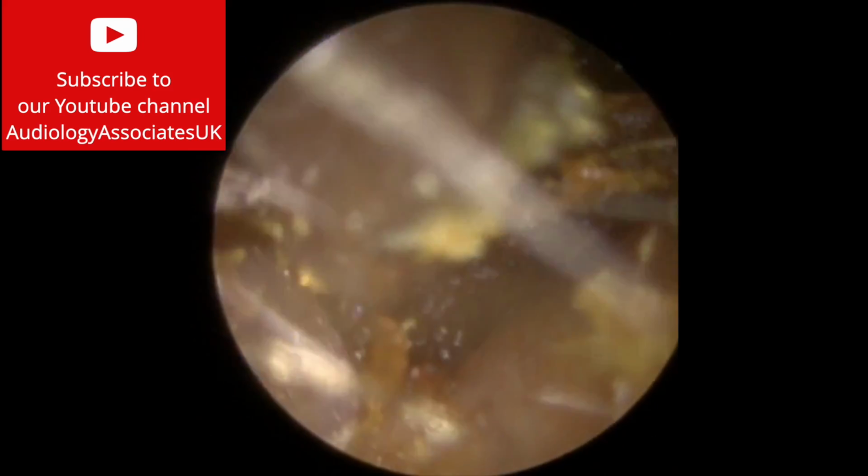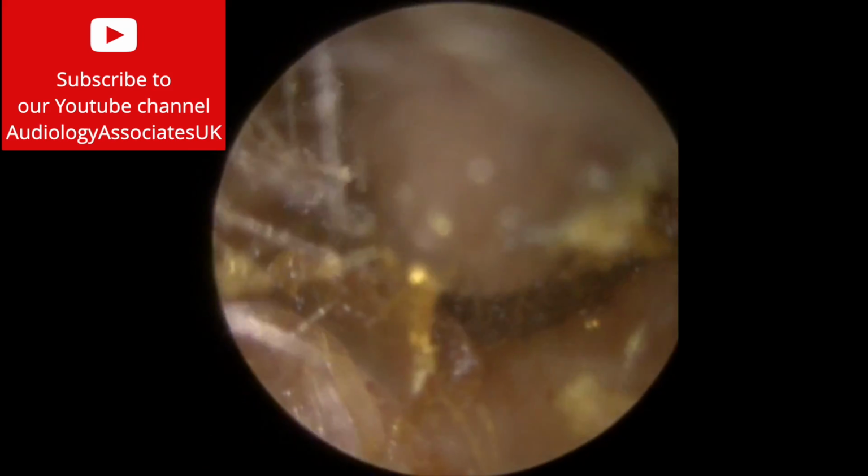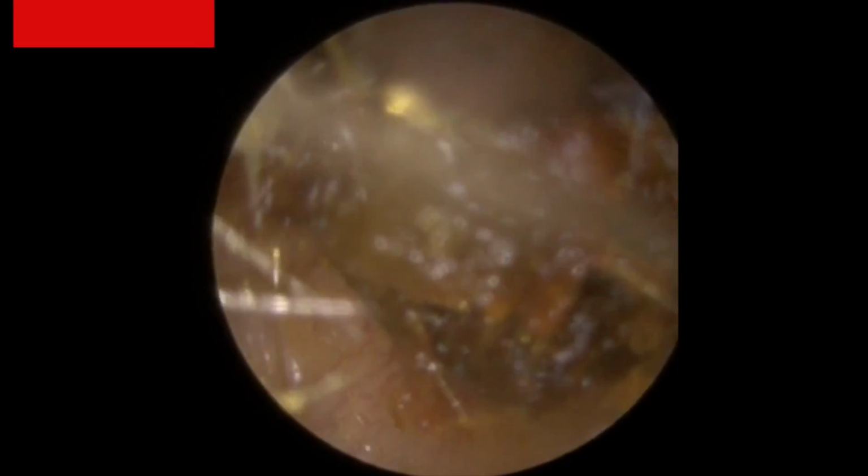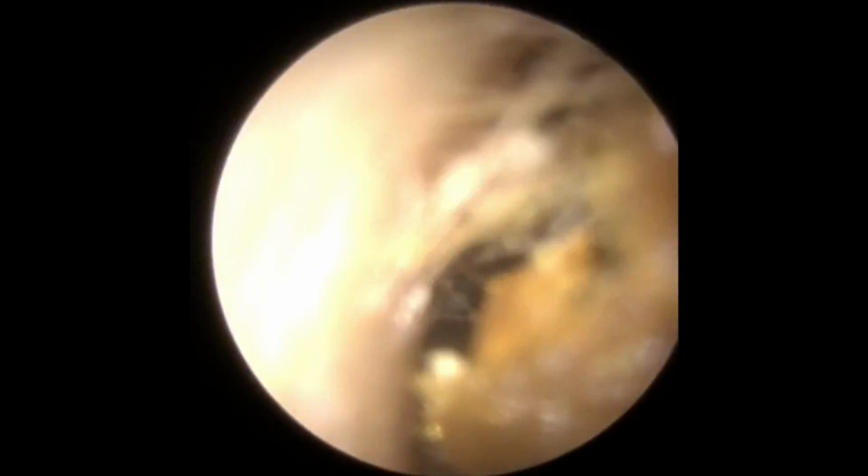You can see that the wax is stretching and then pulling away from the canal wall. So we're working from the left side to the right side now. There you go, slowly coming away, working back up to the right side. So working our way all the way around this piece of wax just to allow us to really get behind and get some traction to getting this out. There we are, nice big chunk just came away.